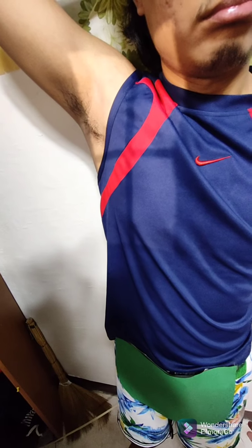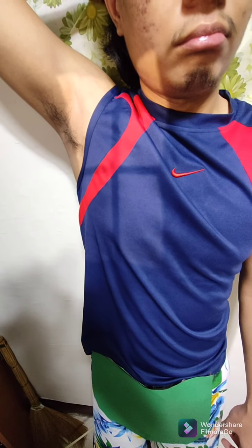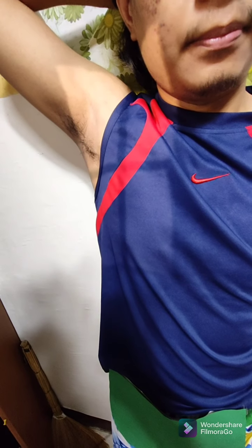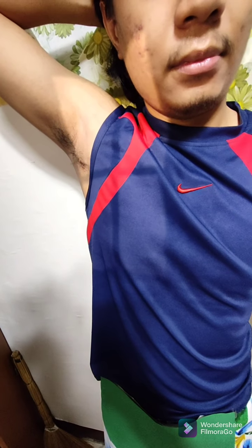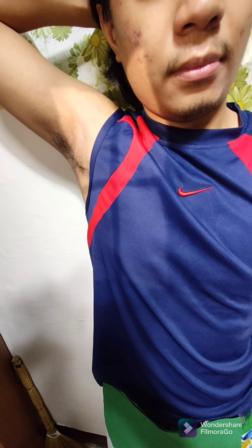And before shooting the beam, make sure to instruct the patient to practice orthostatic breathing. This means gently breathing in and out without moving the shoulder or the chest. So sir, gently lang po paghinga mo sir. Inhale, exhale. Gently lang sir, nang hindi gumagalaw ang dibdib at kamay mo.